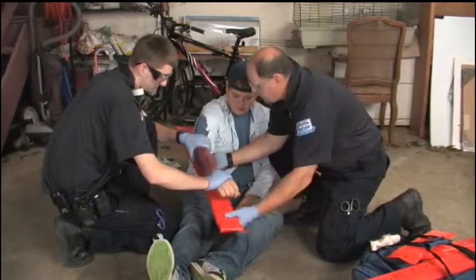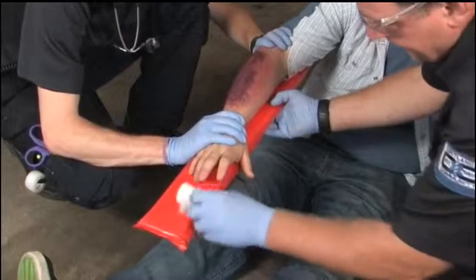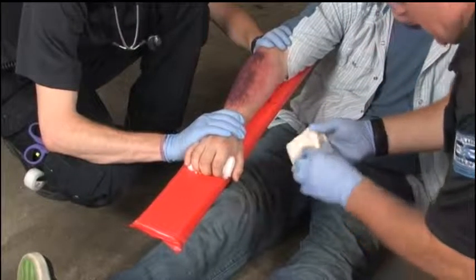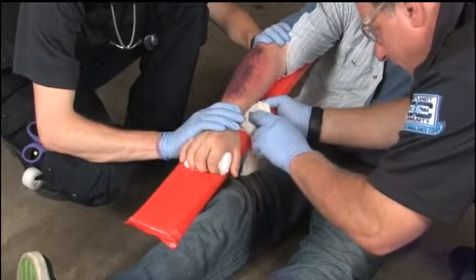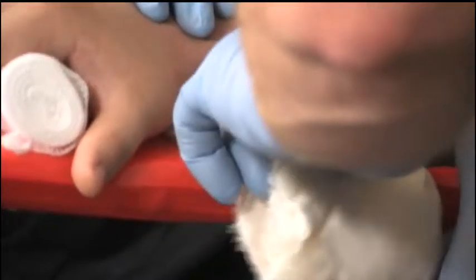With the second rescuer maintaining stabilization of the extremity, position the splint on or under the extremity. Pad the splint where necessary. Rigid splints need padding to avoid pressure points within the splint. Other splints may need padding in areas of void. Gauze, pads, towels, or other soft items can be used as padding.